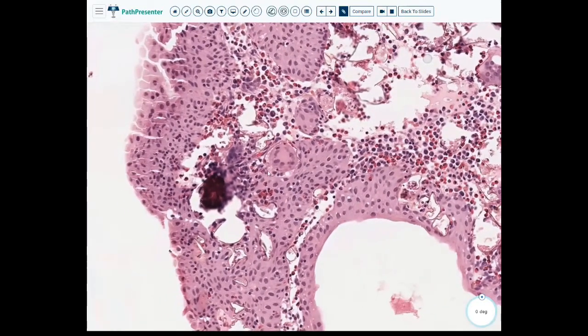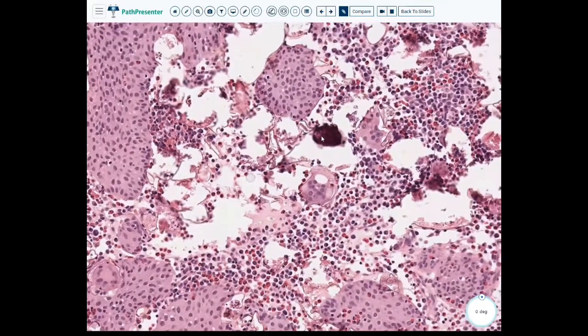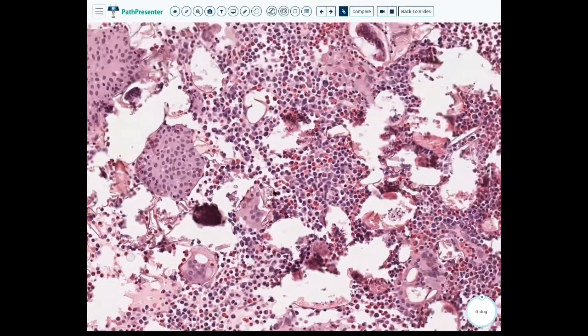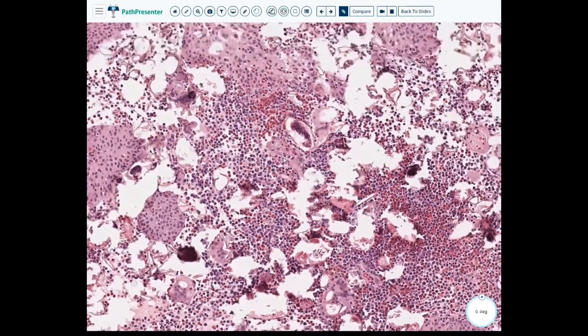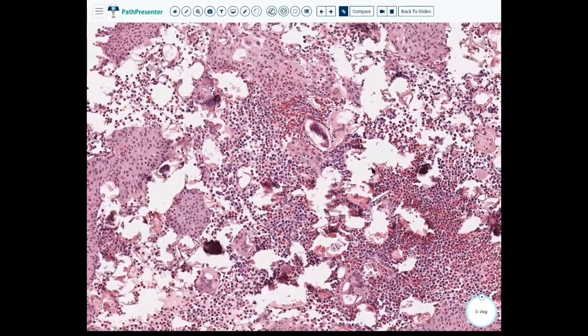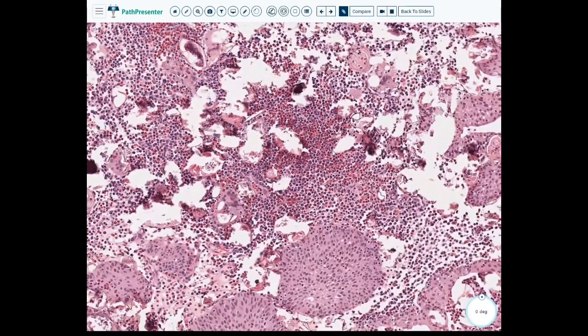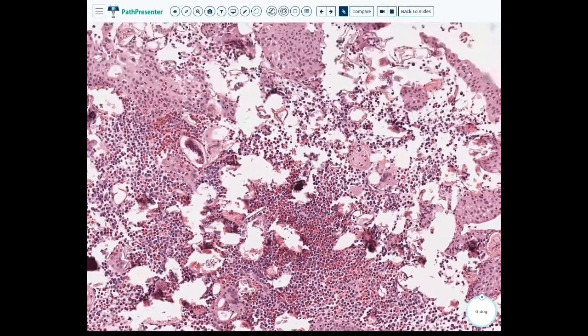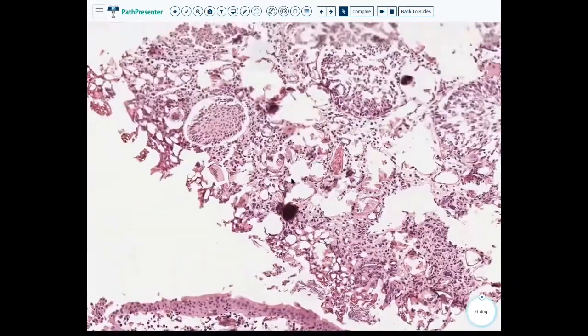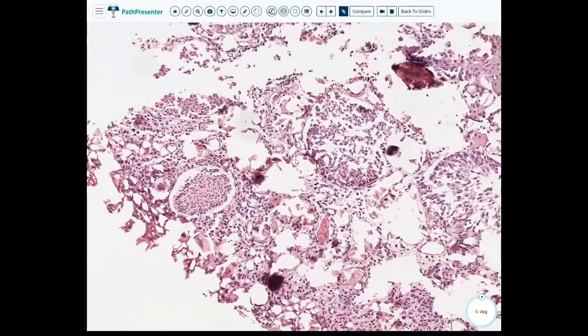And this is actually the pathology. So this is actually something that we saw in lecture. You can make out some of the organs here. And just that sea of eosinophils. So eosinophils in the bladder should always raise your suspicion of parasites. And that is indeed what we're looking at here.